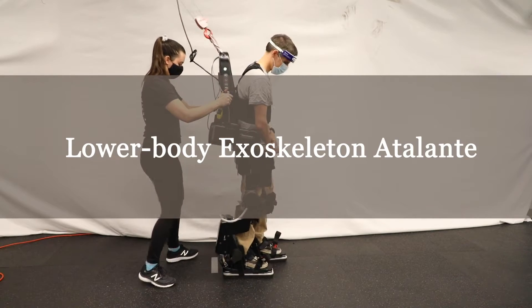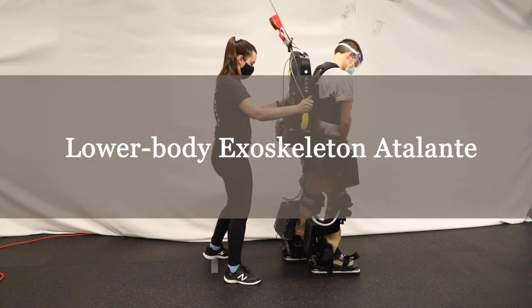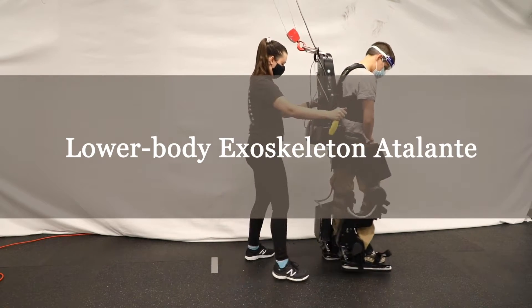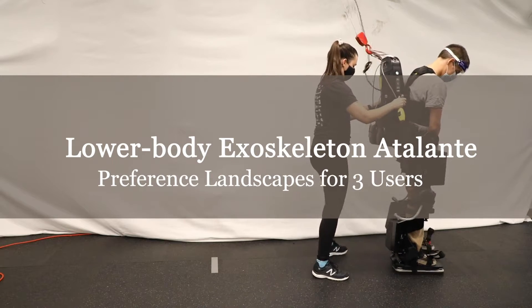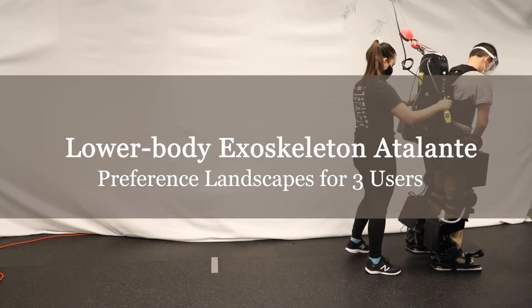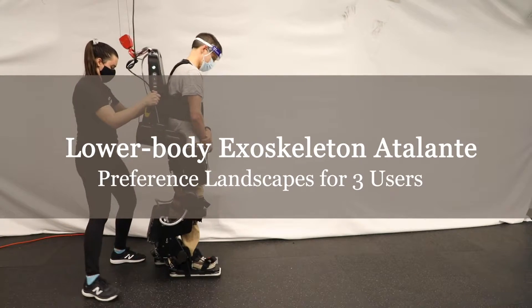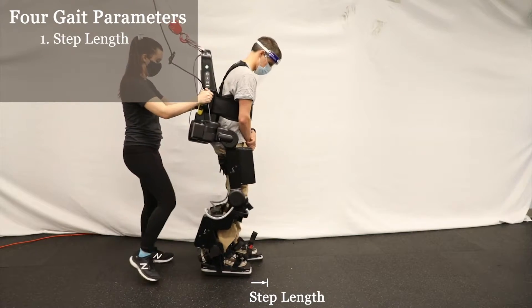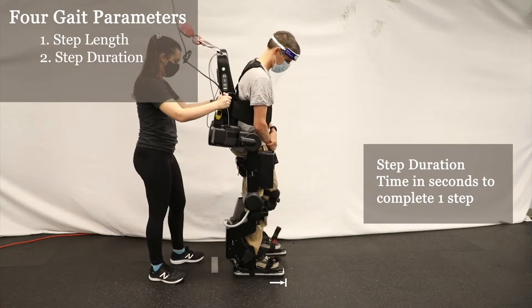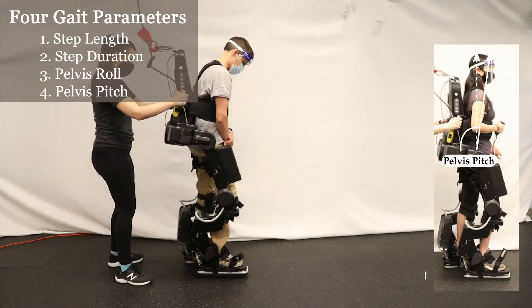After validating ROYLE's performance in simulation, we deploy the algorithm on the lower-body exoskeleton to learn three users' preference landscapes over four gait parameters: step length, step duration, pelvis roll, and pelvis pitch.